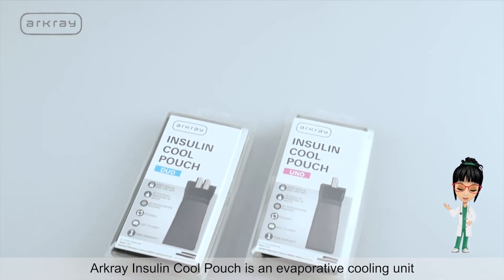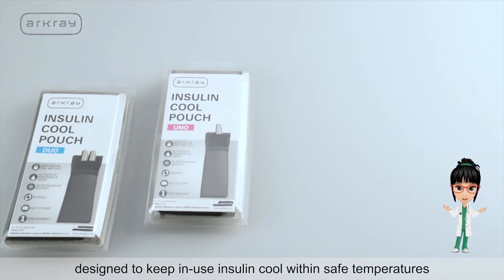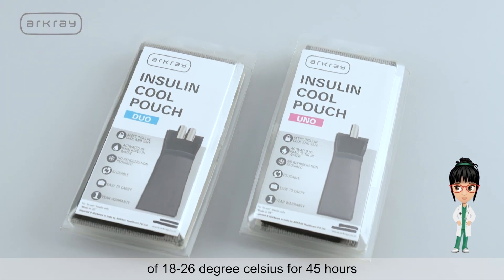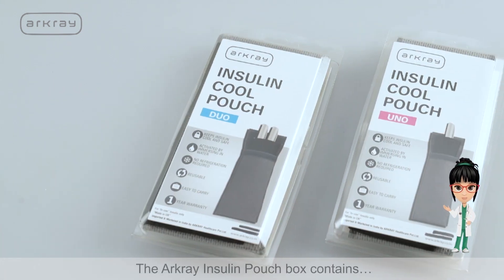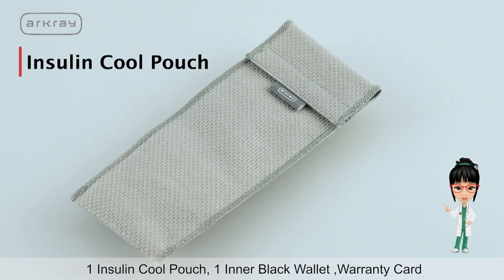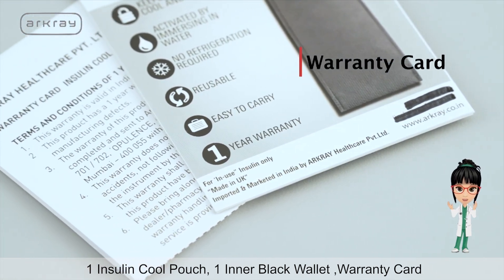ArcGrey Insulin Cool Pouch is an evaporative cooling unit designed to keep in-use insulin cool within safe temperatures of 18 to 26 degrees Celsius for 45 hours. The ArcGrey Insulin Cool Pouch box contains one Insulin Cool Pouch, one inner black wallet, and a warranty card.